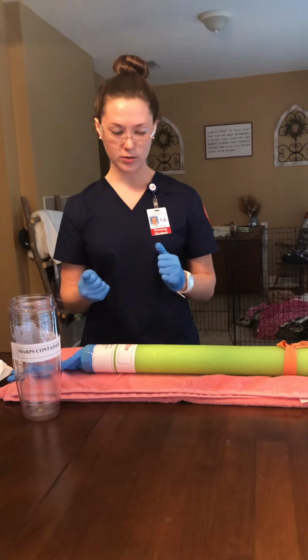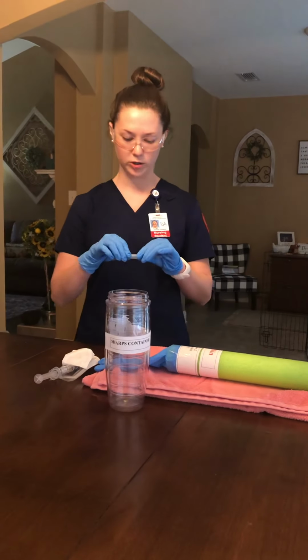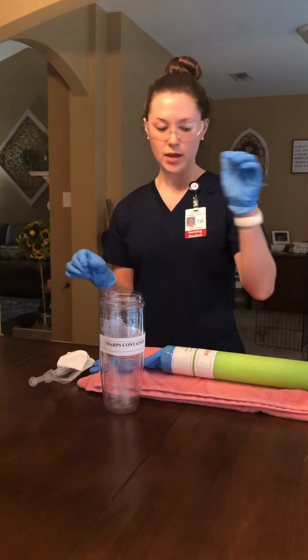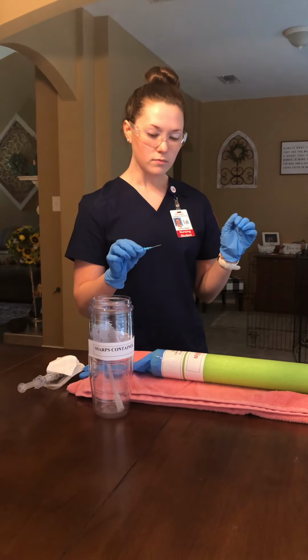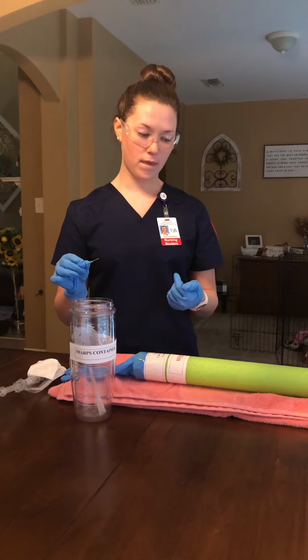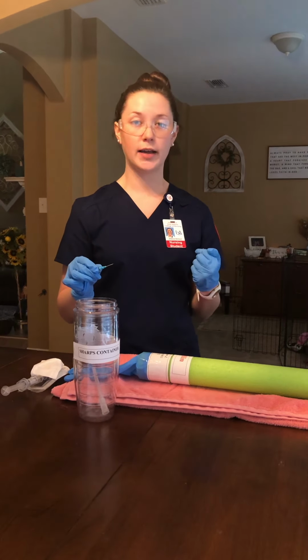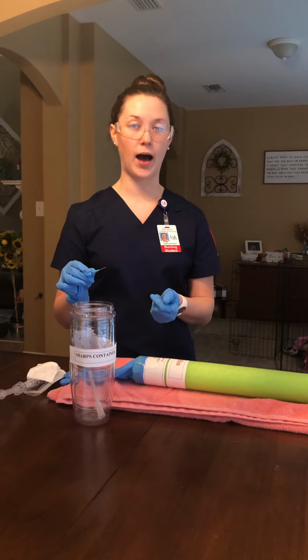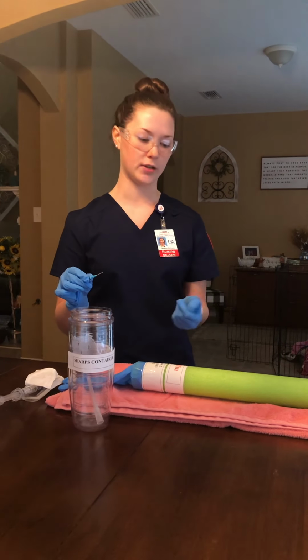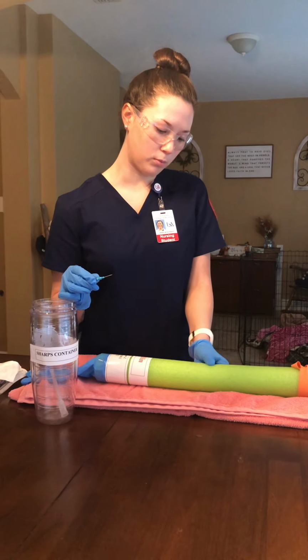So the next thing I'm going to do, after it's completely dry, it would be time for me to do the venipuncture. So I'm going to remove this. I'm going to anchor the vein 1.5 to 2 inches below the insertion site, and I'm going to pull it back in the opposite direction of the insertion site. So I'm going to do that. I'm going to pull it back.